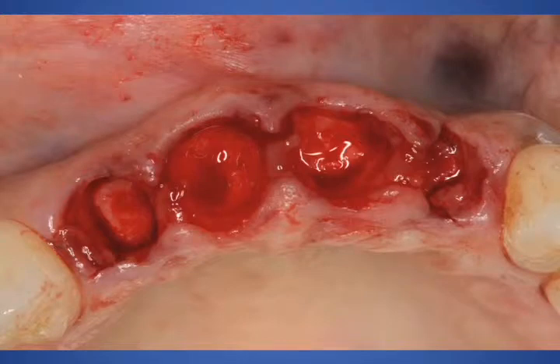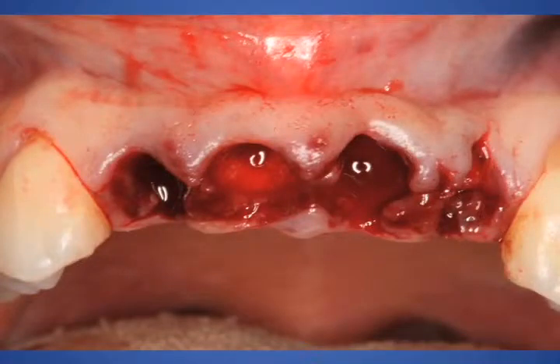And you can see after the extraction we have viable bone to work with, very shallow socket sites, so I feel very comfortable in the placement of our dental implants. We have pretty good width also because it's an immediate extraction situation. The buccal plate is really intact and should turn out to be a nice situation for us.